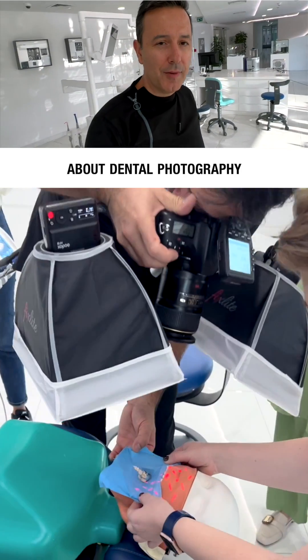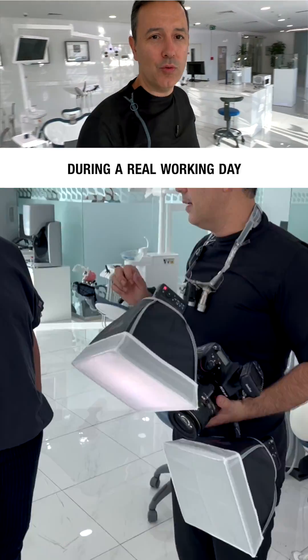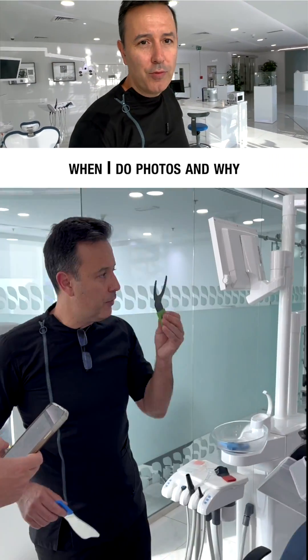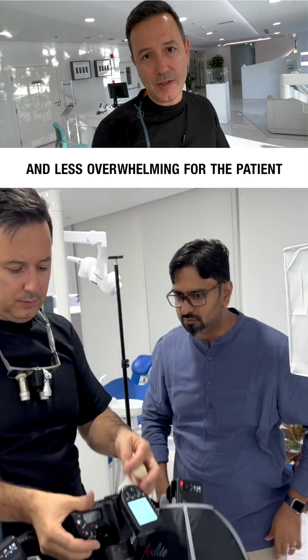Of course, I didn't forget about dental photography, which is a hot topic nowadays. But again, real stuff — I'm showing how and what I do during a real working day: when I do photos and why, and all the tips and tricks to make this process fast and less overwhelming for the patient.